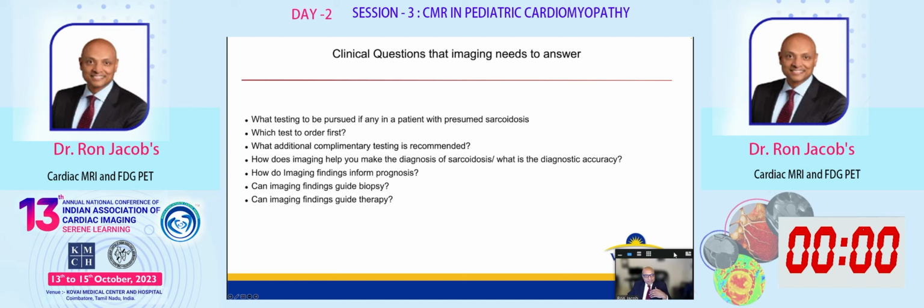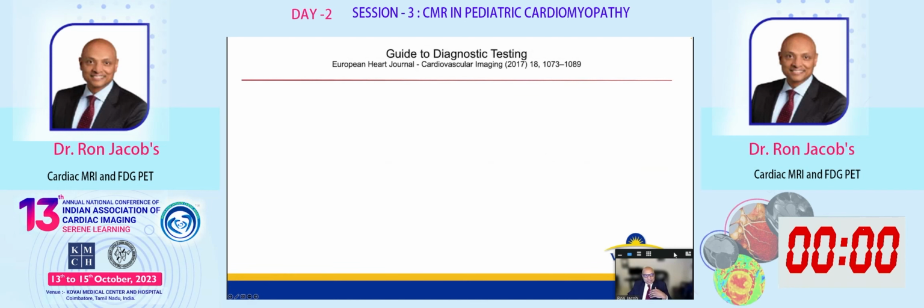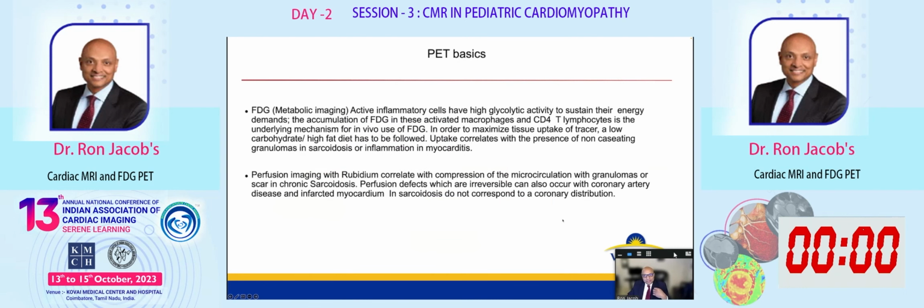for a single test. So, complementary testing, this is again the same algorithm, and even with CMR in a patient like this, you suspect sarcoidosis. The PET will help you in terms of your inflammatory burden and perhaps guiding therapy, and I'll go into some other pieces of information that PET is helpful with.